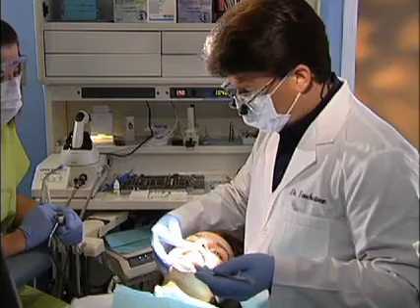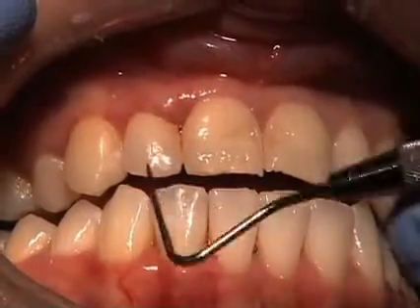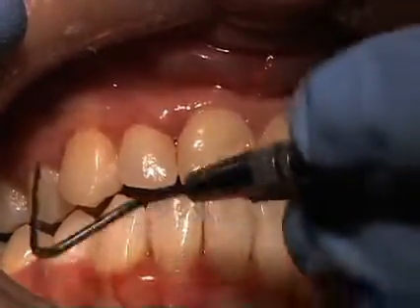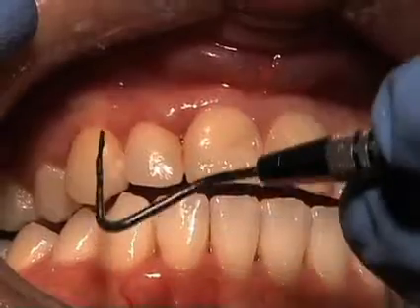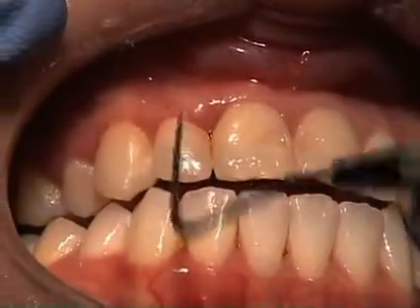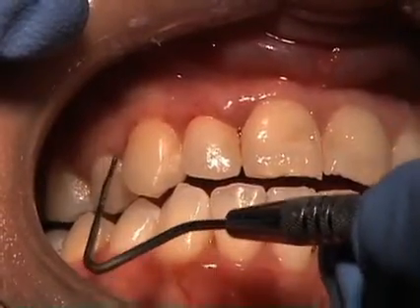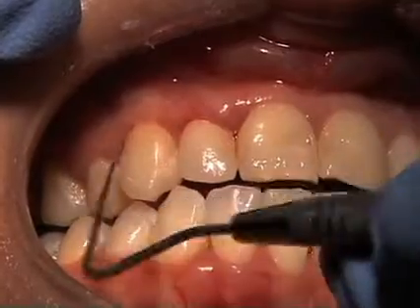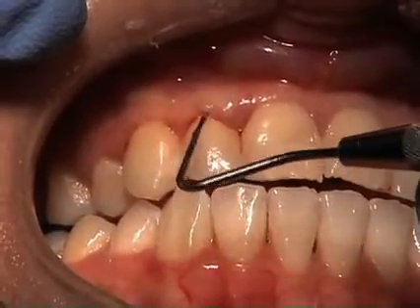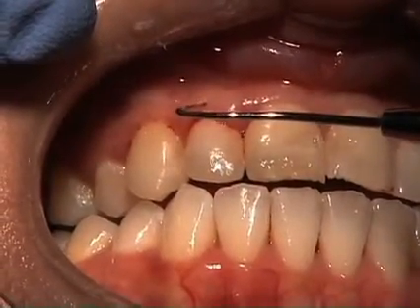Now we're planning to do a little gingival sculpting in order to achieve better symmetry. You'll notice that the crown length for this lateral is shorter than that of this lateral. Likewise, it's very pronounced with the premolar, less so with the canine. So we're going to do a little sculpting here, here, and here. In order to prepare for that, we want to measure the depth of the pockets. We've already taken a look at the x-rays to determine her bone levels, and we can further confirm that with a little bit of probing with the explorer.